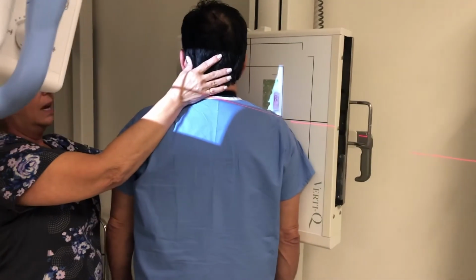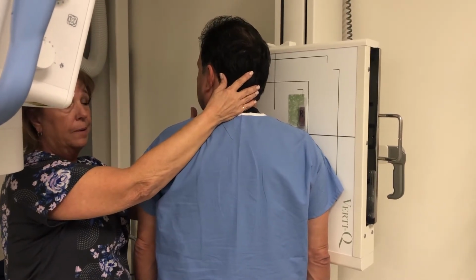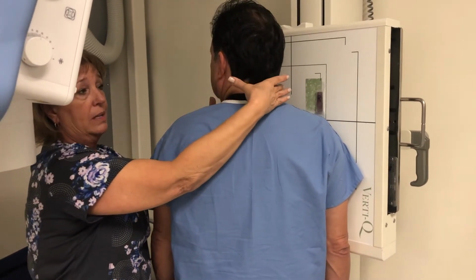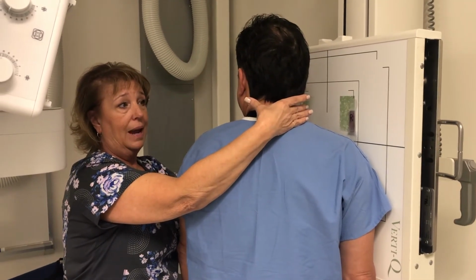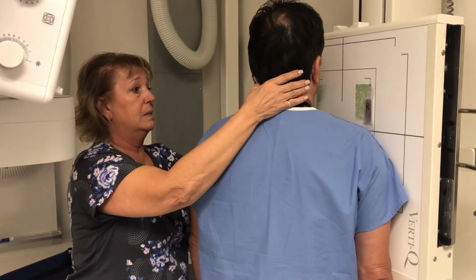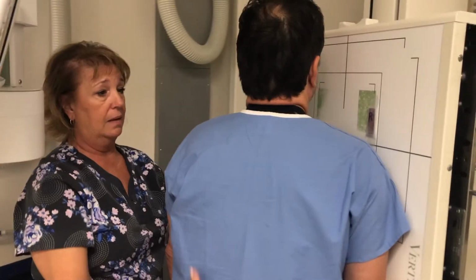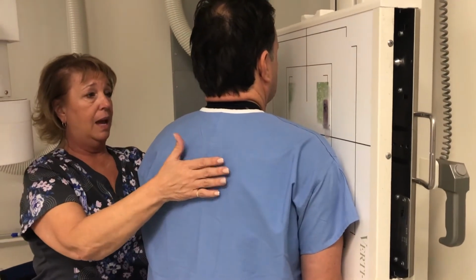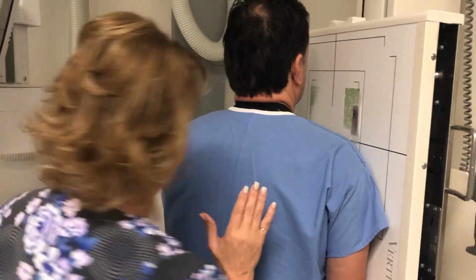At the clinical site, you may see techs turn the head lateral, but what that does is twist C2 on C1, and it can actually close the vertebral foramina. So it's best if you keep the entire mid-sagittal plane together. So head is straight, patient is angled 45 degrees.